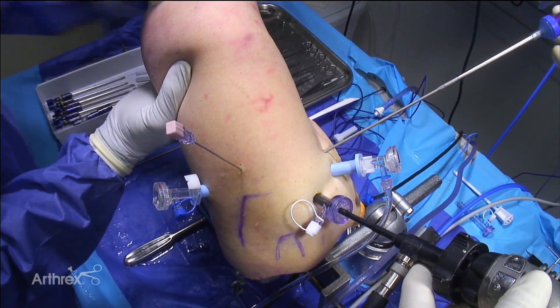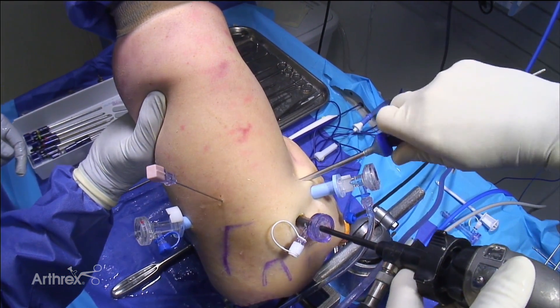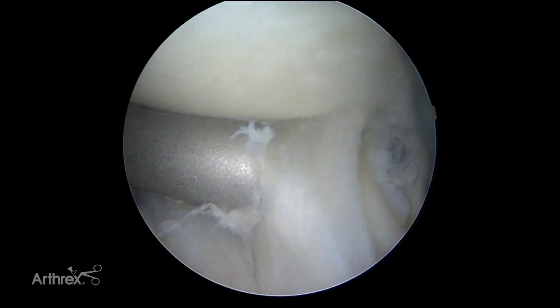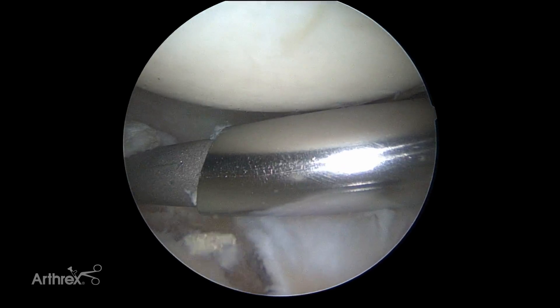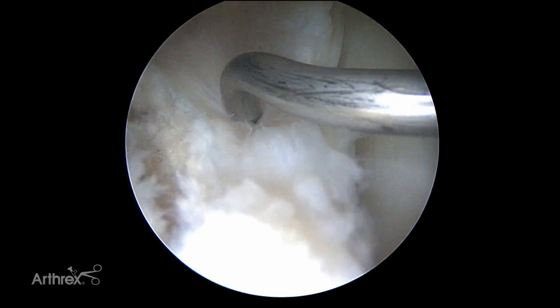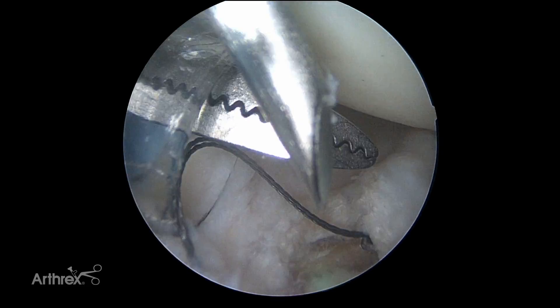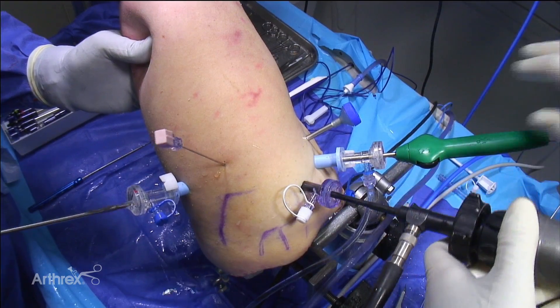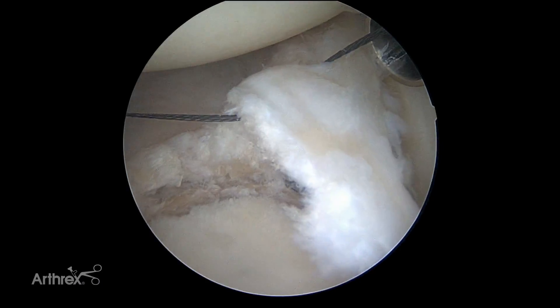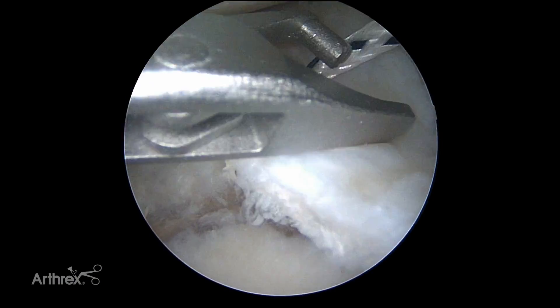Now we'll dilate with our spear, and over the top of the spear we have that 4.5 inner diameter metal cannula that will allow us to insert instruments as well. We push that cannula down into position. The next thing is to place our labral tape — we'll take a quick pass, come through the standard anterior portal, pass that through the posterior portal, bring it out, and thread this labral tape with the black line in it — the tiger tape.